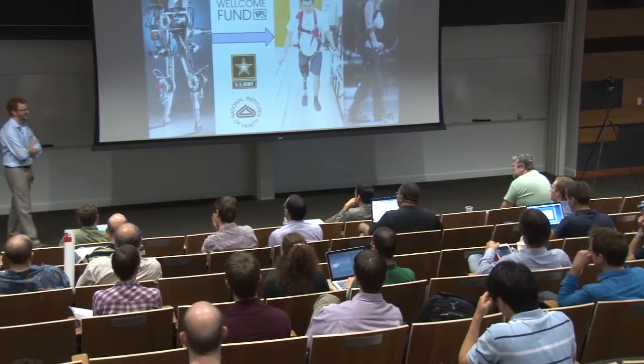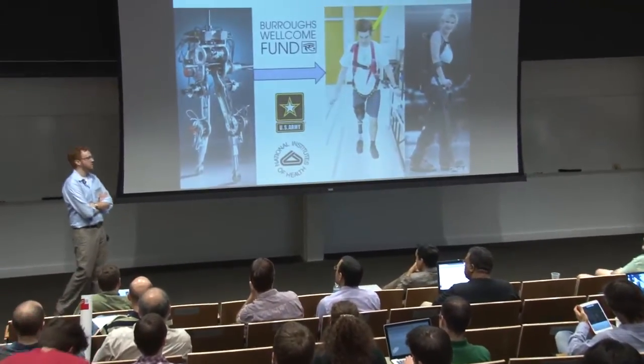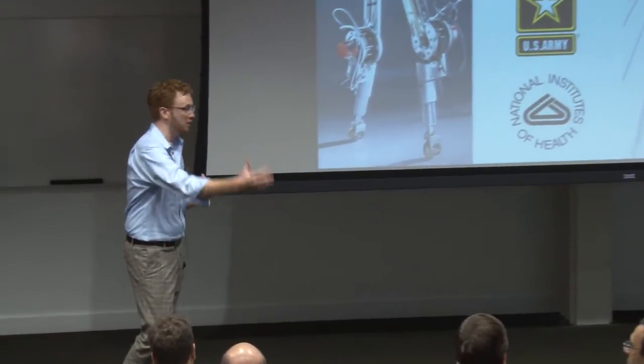A little bit of a misnomer then, right? So you could certainly think of estimating. Yeah, it depends. What are you estimating? What state are you estimating, right? So it could be that you're estimating all variables of the system to try to feed forward all the variables, or you could be estimating just one. And what we're trying to say here is that there's one variable, and that's all you need to know where you are in the gait cycle, and then you can define all joint patterns as a function of that. Maybe that's the case, yes. That certainly could be the case. And if that's so, then there's very fast continuous modulation of this estimate. Very fast, I would say, based on these results.